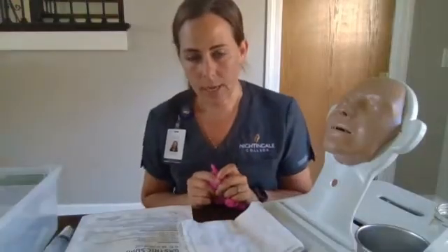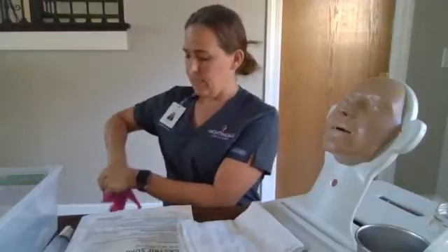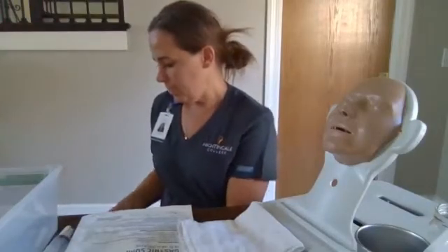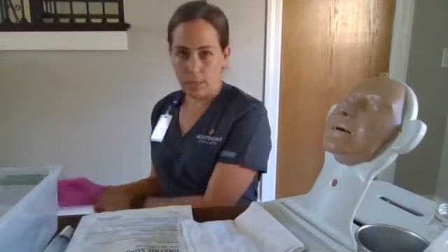We are going to set up, raise the bed to a good working height. We are going to place him in high Fowler's and place our gloves.